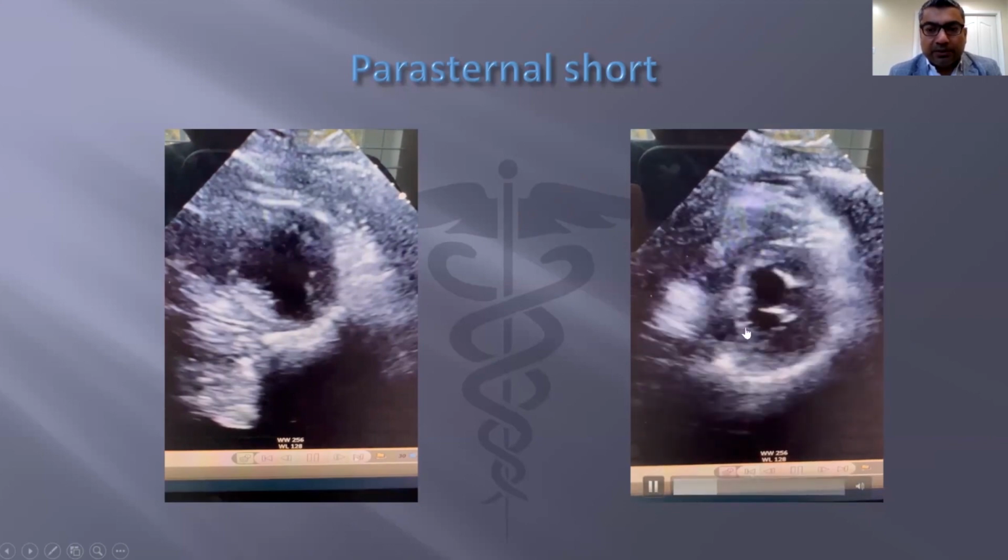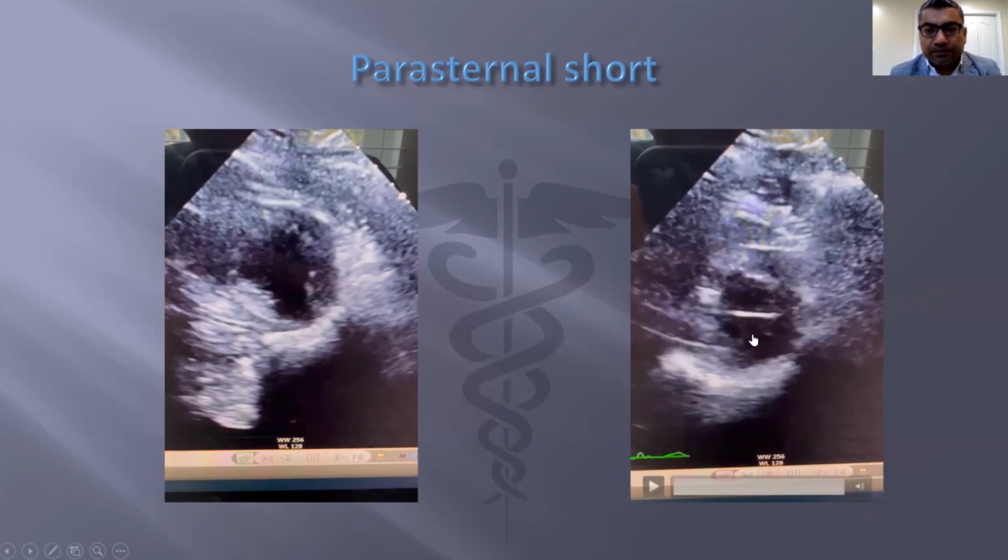Then if you do this one, which is almost towards the mitral valve, many times you miss many things because the base of the heart can be hypercontractile in many states, including stress-induced cardiomyopathy and non-ischemic cardiomyopathy. You may have wall motion abnormalities at the apex or mid-wall, or even septic shock causing a hypercontractile base of the heart. So if you are doing the parasternal, always look at the mid-cavity level by moving the probe up and down or sideways.